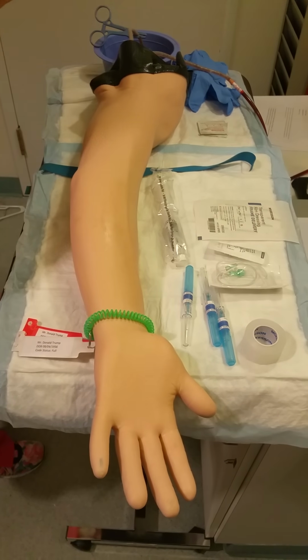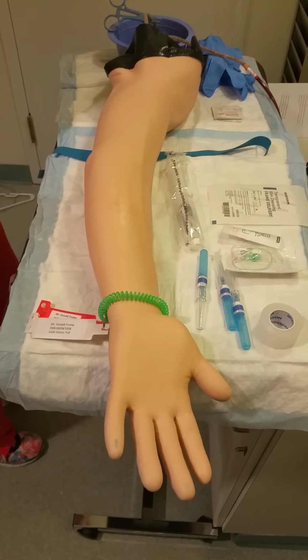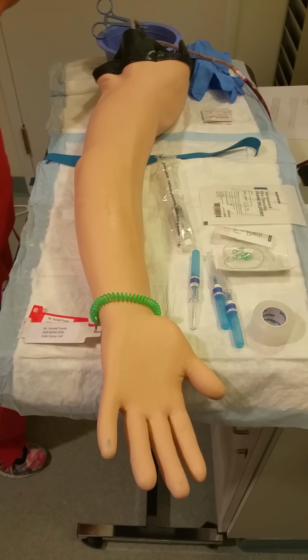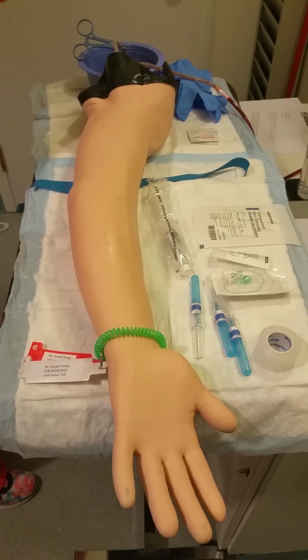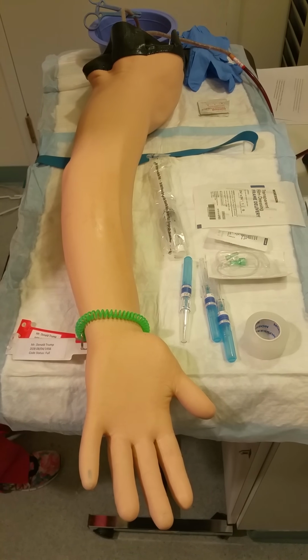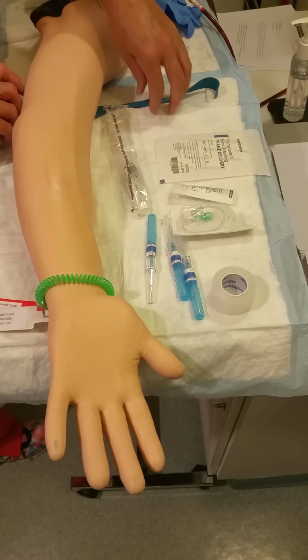You should be familiar with the procedure, and you know it does involve a needle stick, and I'm going to put a tourniquet on your arm, and it's going to be tight, but the discomfort is very, very brief. So if you're all right with it, I'm going to go ahead and start my procedure. Go ahead. Thank you, Mr. Trump.